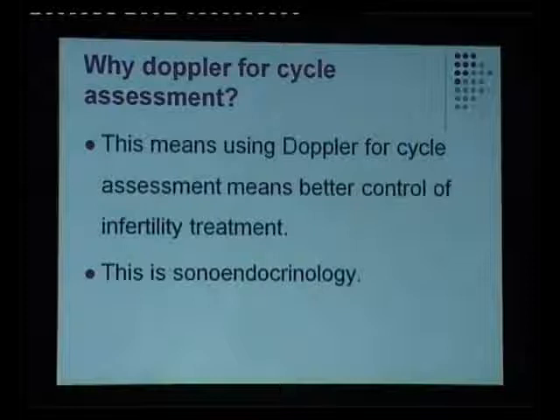The vascular changes at the time of impending ovulation include increased vascularity of the inner wall of the follicle and a coincident surge in the blood velocity just prior to eruption. A marked increase in the peak systolic velocity around the follicle in the presence of a relatively constant PI could be a sign of follicular maturity and impending ovulation. This means that if you have a persistently low RI with a rising PSV, this follicle is proceeding towards rupture.